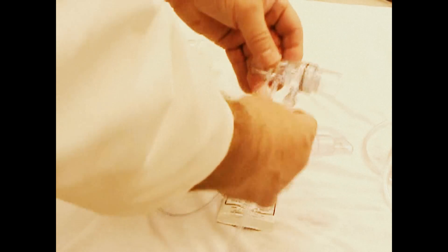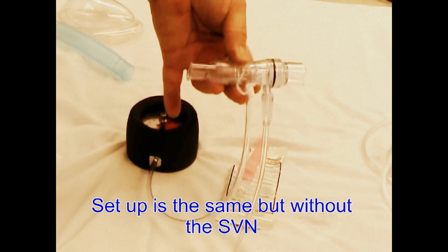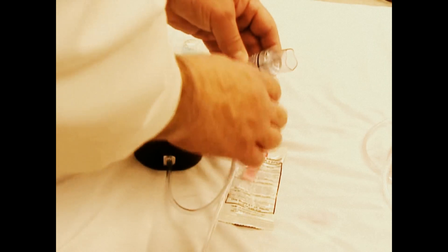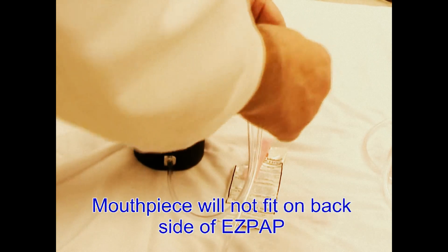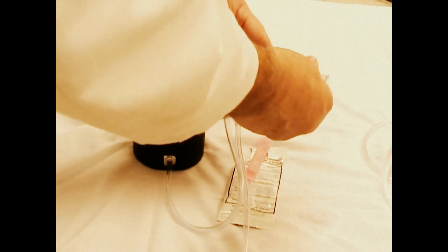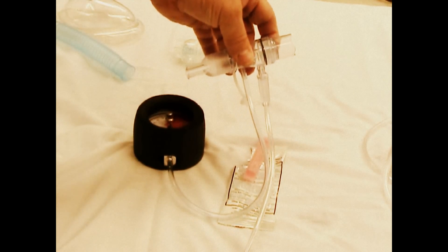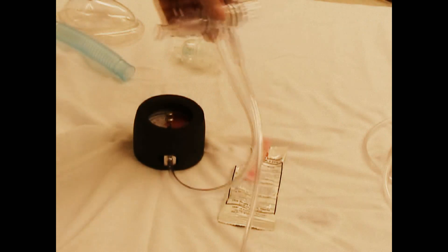Therapy without nebulization: simply attach the mouthpiece to the end of the EZ-Pep. You'll notice the end of the EZ-Pep has a riffled or wavy end — it's also the end that the mouthpiece will not fit onto. This is the exhalation end. The smaller end is the mouthpiece end.